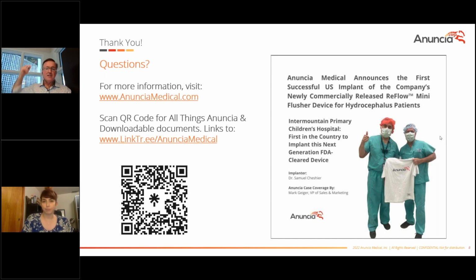One thing to note, if you run into this with your device, is that if you can't depress the system, it's not a 100% test for this, but your catheter may be clogged, and that would be a time that you would then contact your neurosurgeon to talk about next steps.